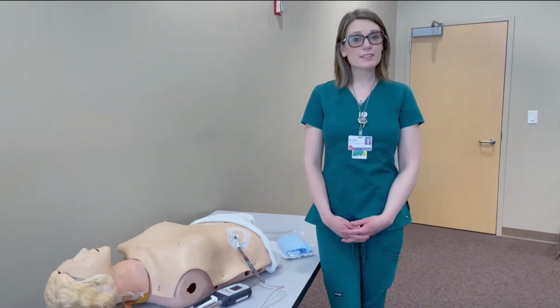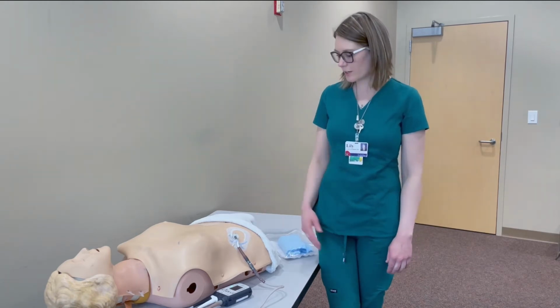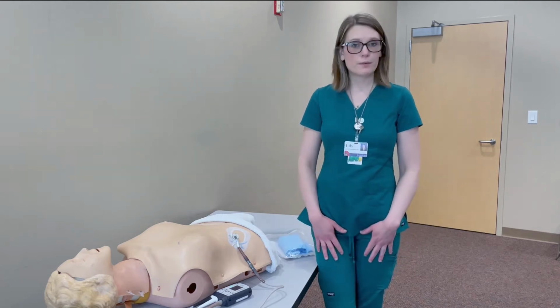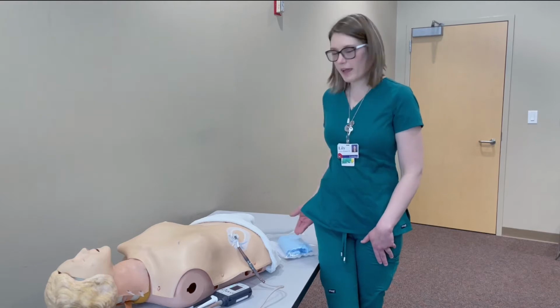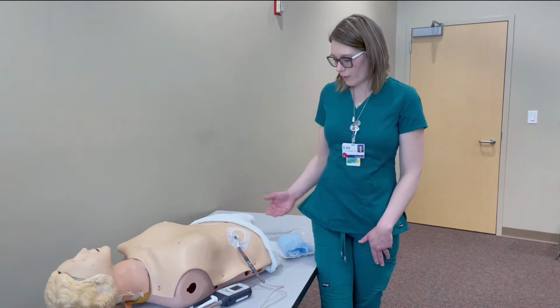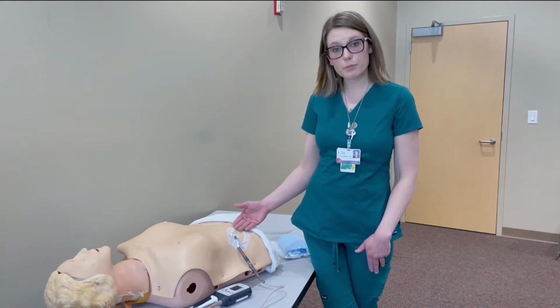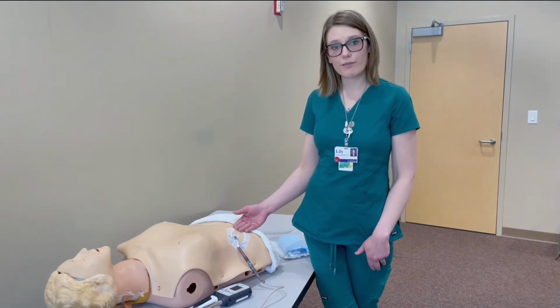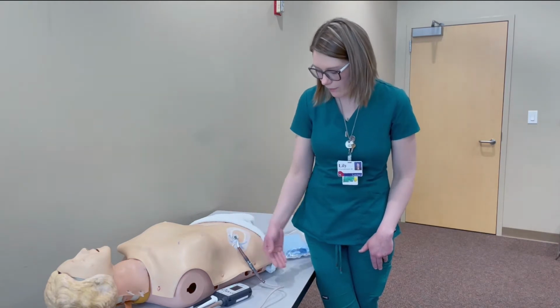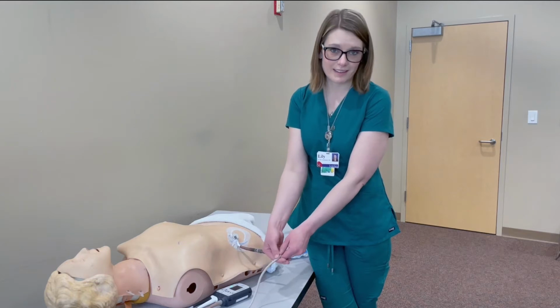All right, so to get started, you're going to have your family member lay down in a comfortable position. Make sure that you can easily access the site, and make sure that anyone within the room is going to be either applying a mask or a hair bonnet, which is going to be located inside of the kit. You want to always look at the initial dressing and look for any drainage or signs of bleeding. This is something you'll want to call your LVAD coordinator team about. And then you'll also want to just make sure that you have all the parts that you need. Today we are missing our anchor, which we will be applying at the end of this video.